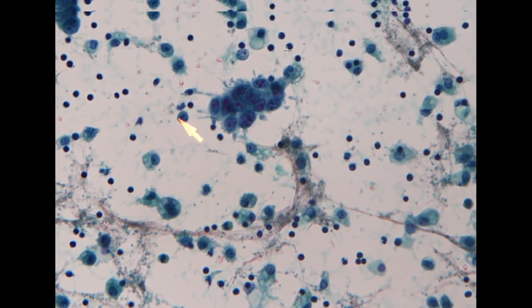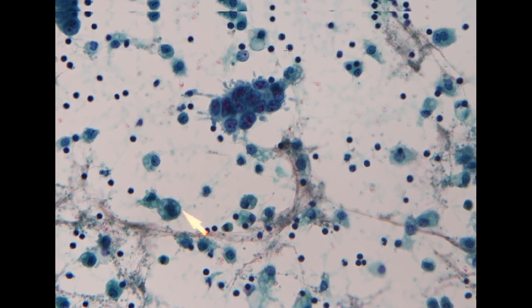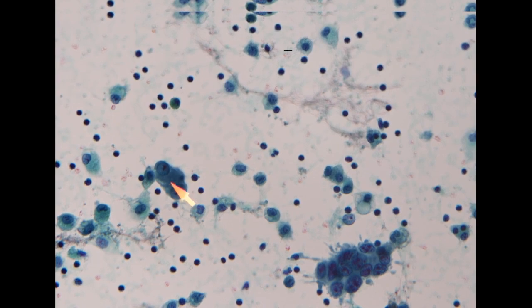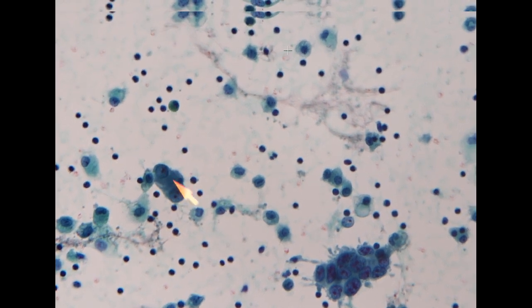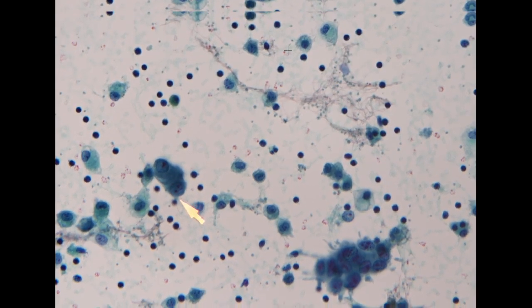So in the background, we do identify quite common single cells with a little bit bubbly cytoplasm. So these look like histiocytes. Additionally, we can also identify a few bigger cells with a vague intercellular window. So these look more likely to be mesothelial cells, reactive mesothelial cells.